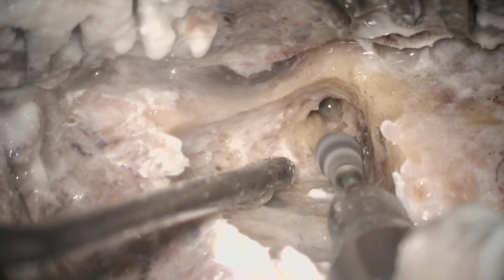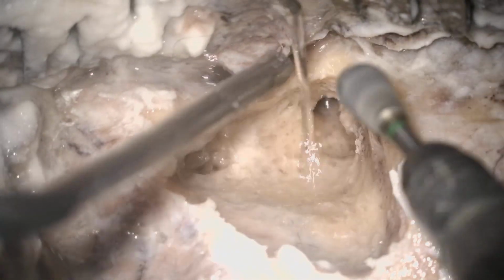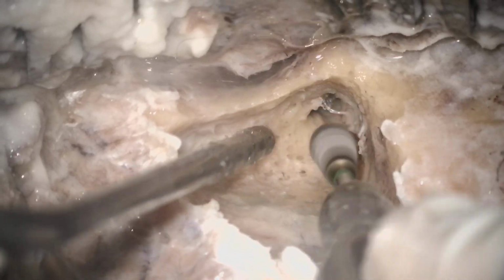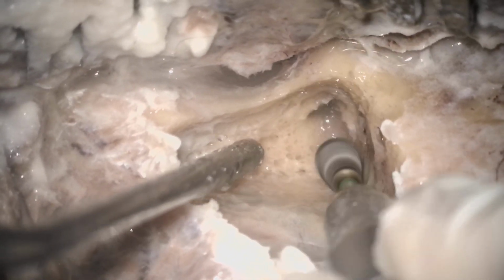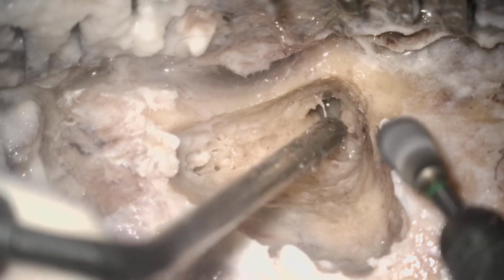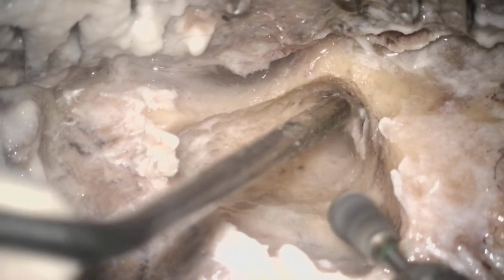All the cellular system is lost, because whenever you are doing cortical mastoidectomy, you are exenterating all the cells. So the cellular system is lost, and after some years there will be some fibrosis. So the gas exchange system that has an important role in middle ear function, you are destroying that part. So there is some difference in opinion. There are so many research studies and their conclusions.